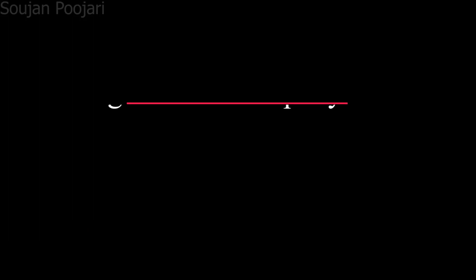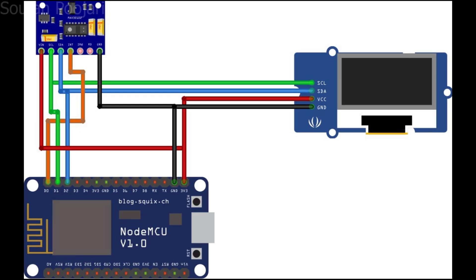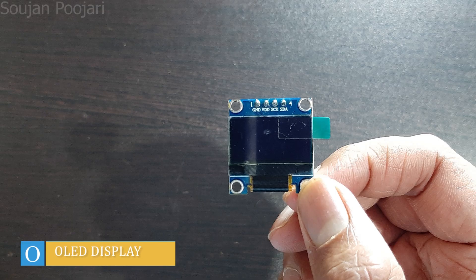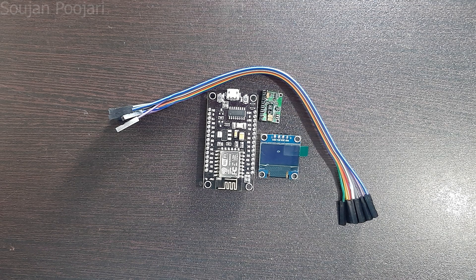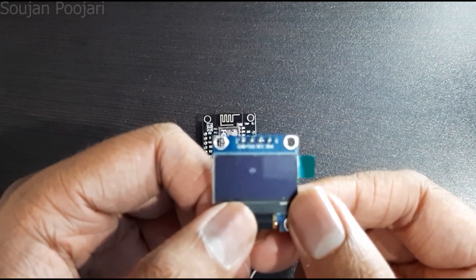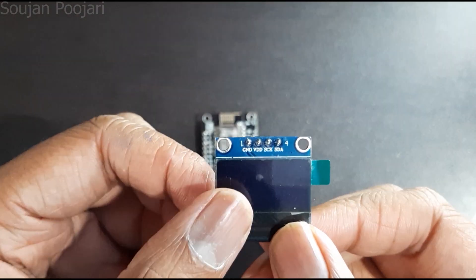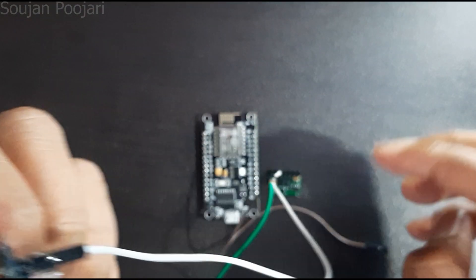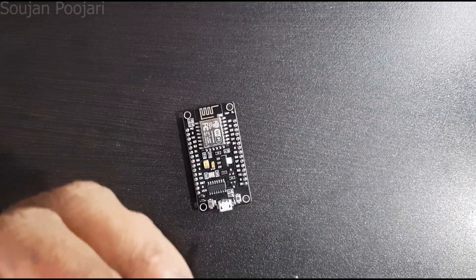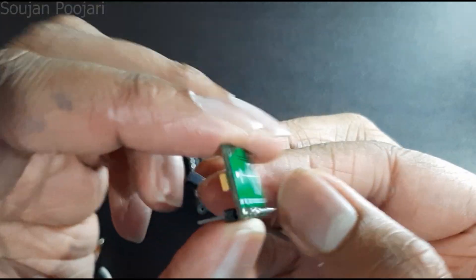Step two: using OLED display. In this step, the additional component is the OLED display. Connect VIN of the MAX30100 to VDD of the OLED display and 3 volts of the NodeMCU.